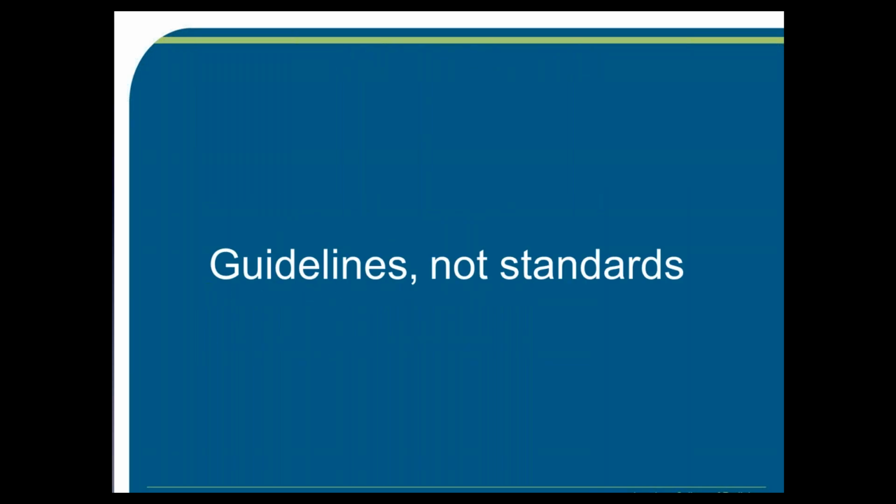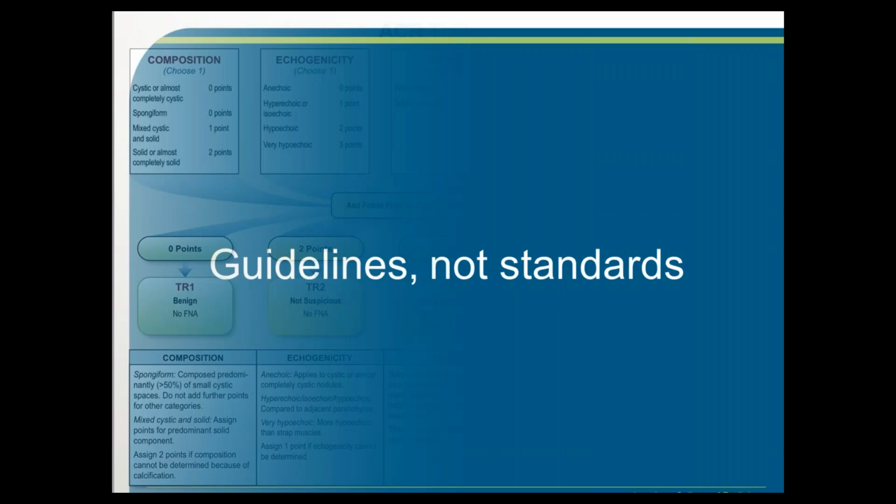Remember that these are guidelines and not standards. That is, it's up to the practitioner who's reporting a thyroid nodule to decide what to do in a given case, and extenuating circumstances may apply.